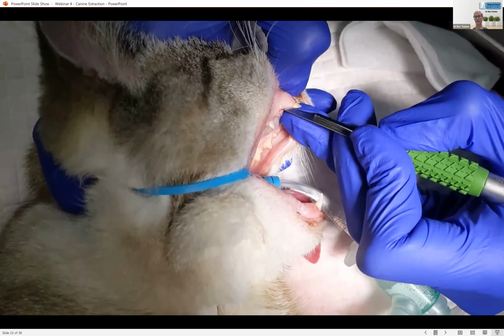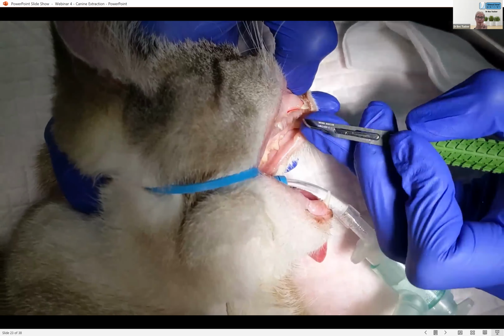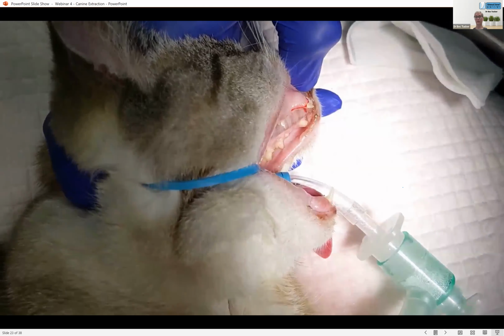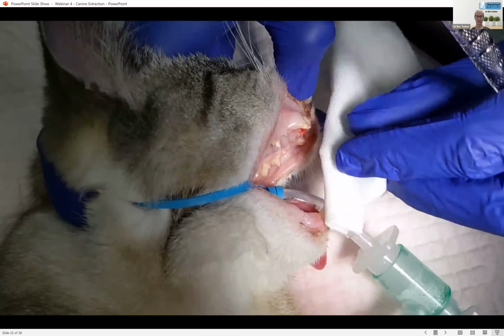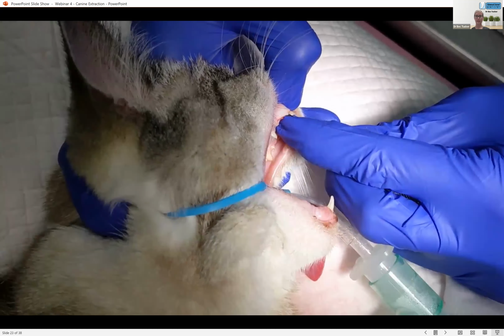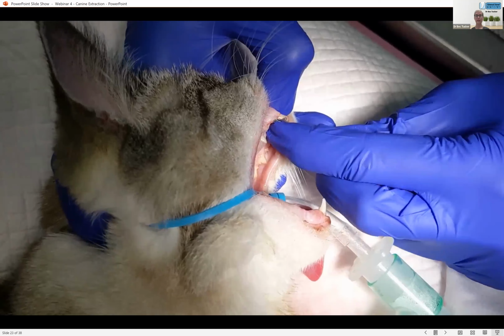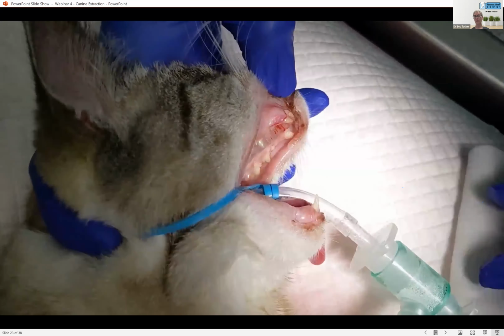And you need really quite firm pressure as well. You'll see I'll put my finger right up there as a stopper, just so I'm really controlled with that blade. The last thing you want to do is slip across the palate and cut the palatine artery. Not fun. So again, using a smaller periosteal elevator here. Same concept, I'll go in and try and get a corner up first.